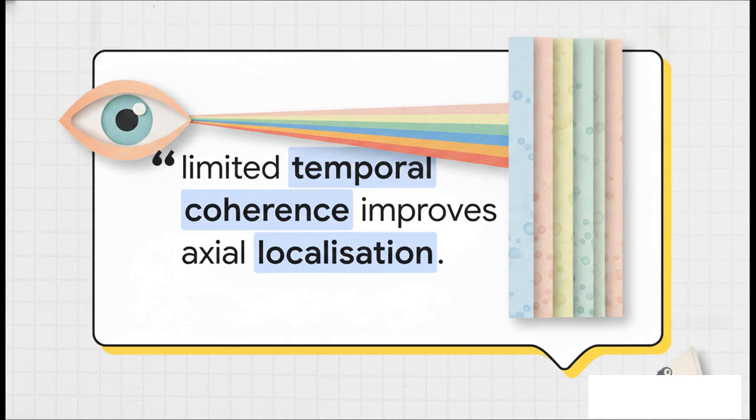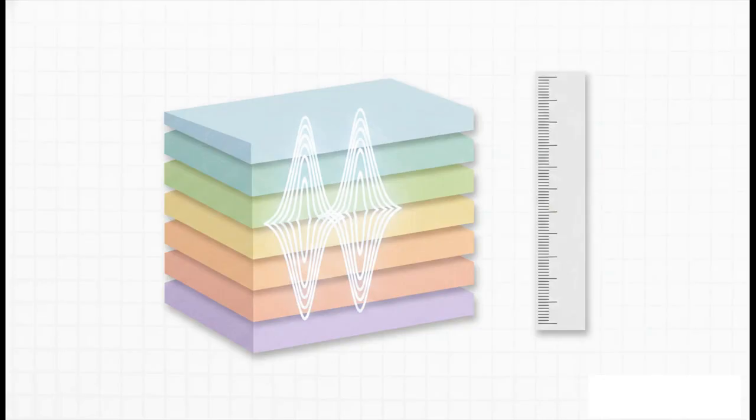Well, usually, when we think of using lasers in medicine, we picture these highly coherent single wavelength beams. But OCT intentionally uses a broad spectrum of wavelengths. By doing that, it purposefully creates low temporal coherence. In other words, a very short coherence length. And this is the massive aha moment of the whole technology.